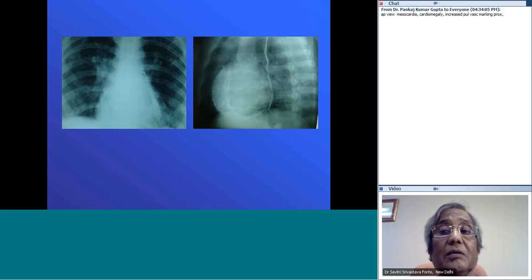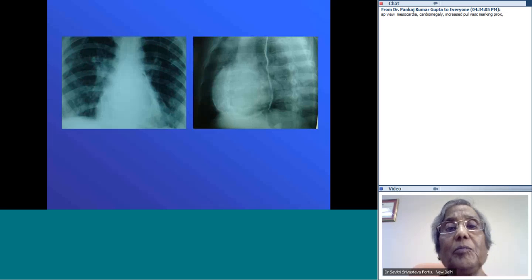Okay, there's only one answer. Okay, I'll go ahead then. Waiting for more answers. Nobody answering. Oh, this is a very, very simple X-ray.